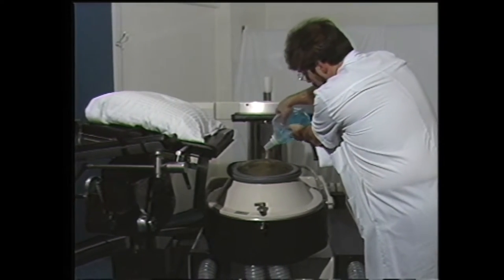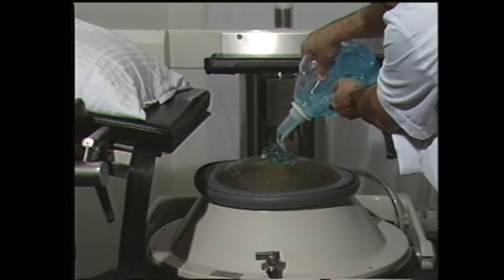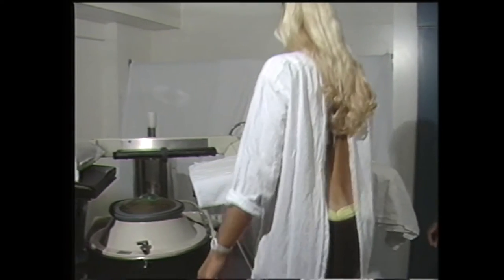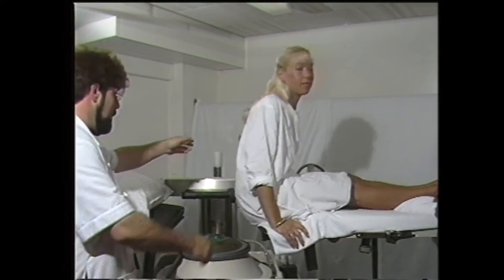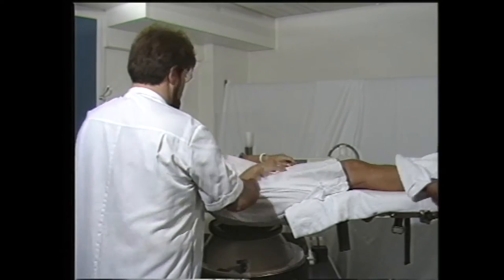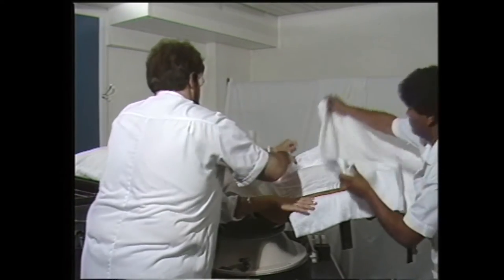La cupule est enduite d'un gel de contact afin d'améliorer la qualité de l'image ultrasonographique. La patiente peut ensuite s'installer seule sur la table puisqu'aucune anesthésie n'est nécessaire en raison du mode d'action et de focalisation des ondes de choc. La cupule est portée au contact de la loge rénale.